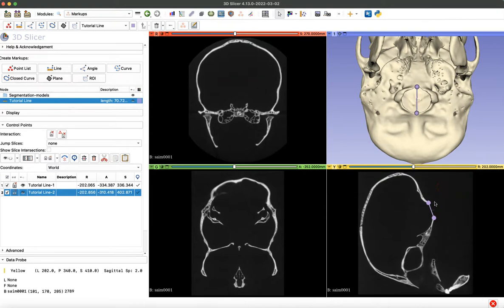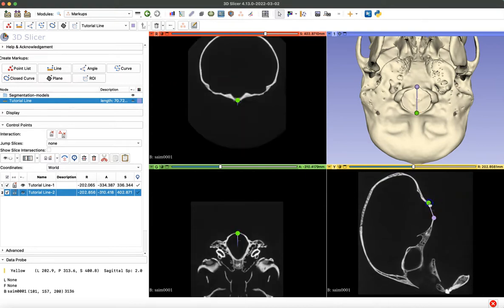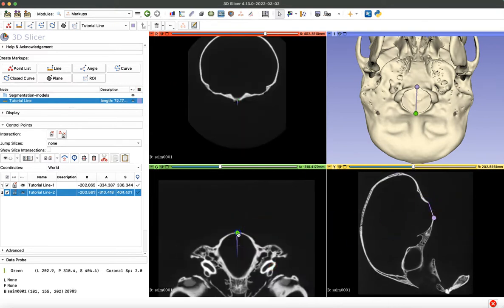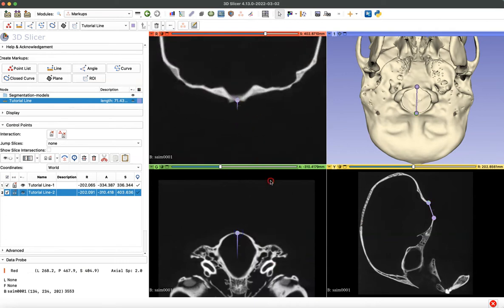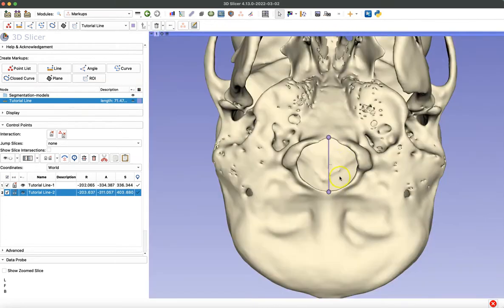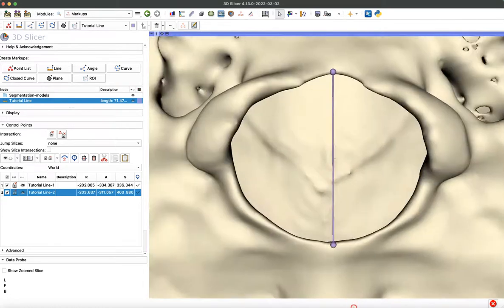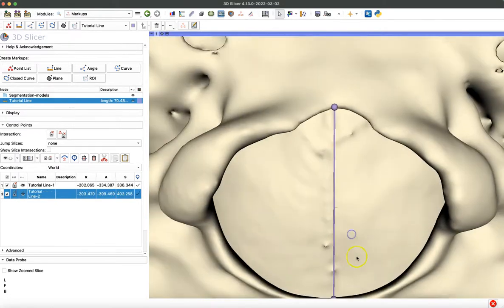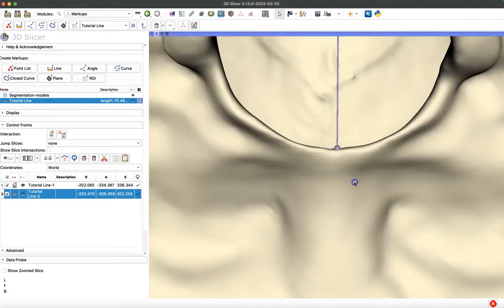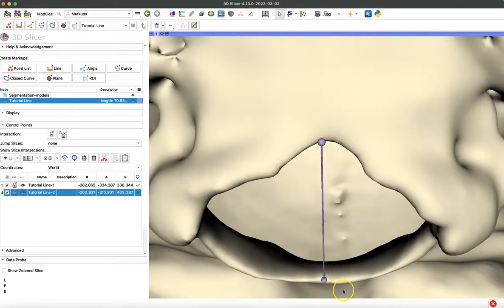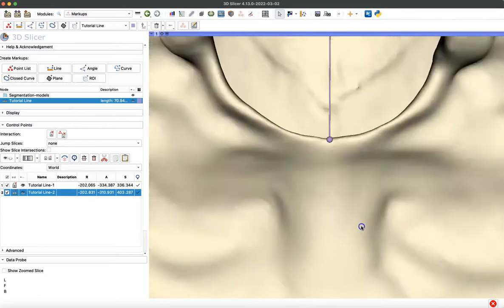You can see your points on your volume and adjust them in this space as well. And when you click on a landmark in this perspective, every single view jumps to that landmark so you can adjust it from every view. So now we'll navigate back to that 3D viewer by clicking on the same icon.